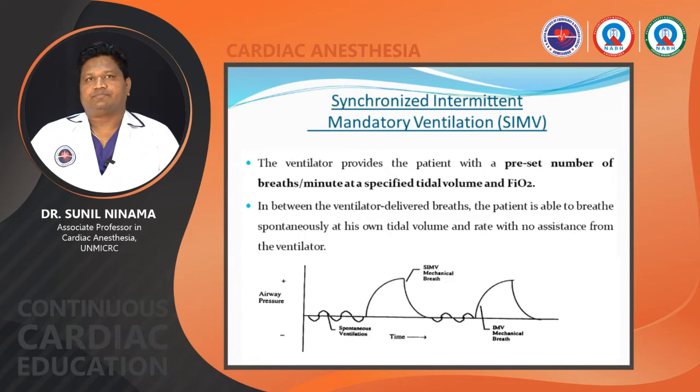What happens in this? In between the ventilator breaths, the patient is able to breathe spontaneously at his own tidal volume and rate with no assistance from the ventilator. So these are the spontaneous breathing trials, and the ventilator synchronizes with the patient's spontaneous ventilations, and it gives the SIMV mechanical breaths.